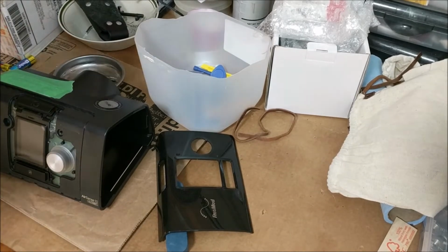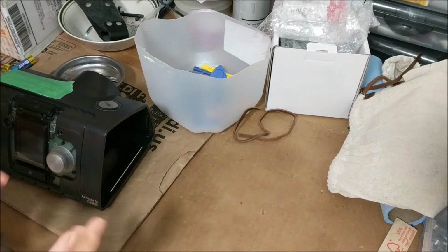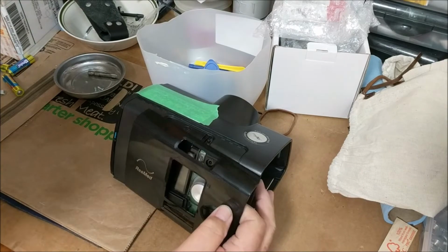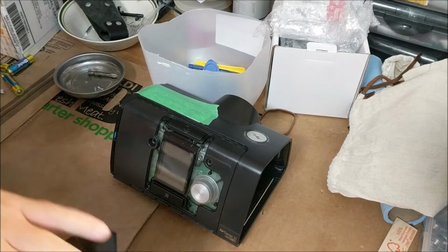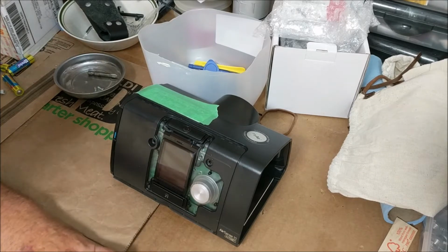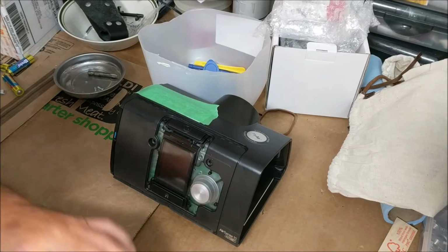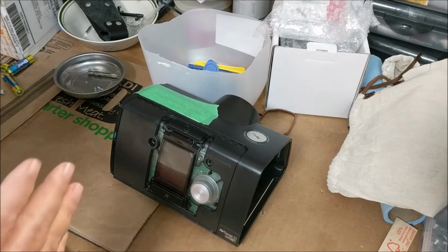Not my typical video, but this may help. If you use a CPAP and you happen to have an AirSense 10, you know it's got a cellular radio in it, and it reports back. They can adjust the settings. I've been using these things for 30 years and I don't want anybody messing with my settings. Not the doctor, not the government, not the insurance company, nobody. I don't want it done without my knowledge, and they can do it on the fly with this.